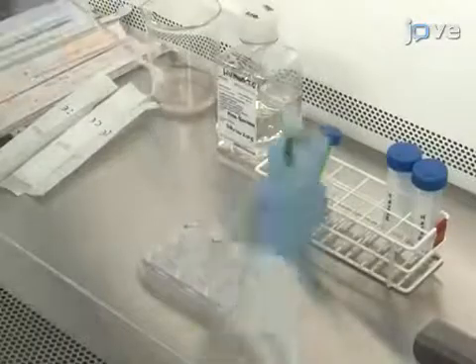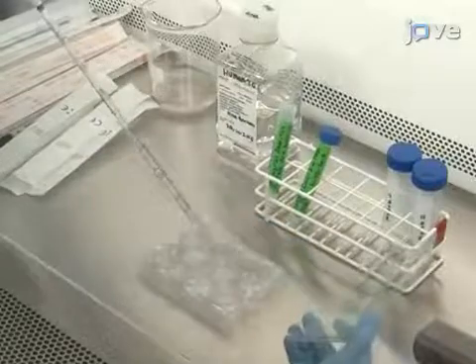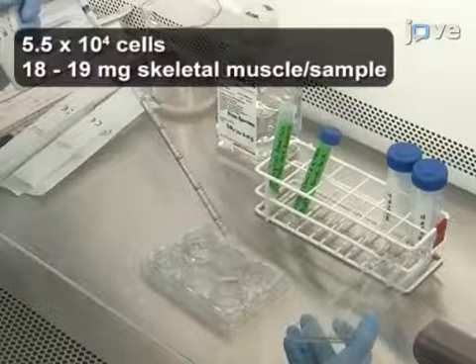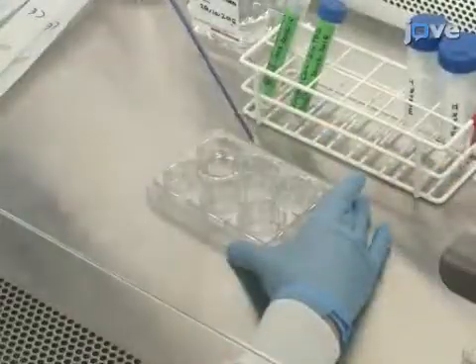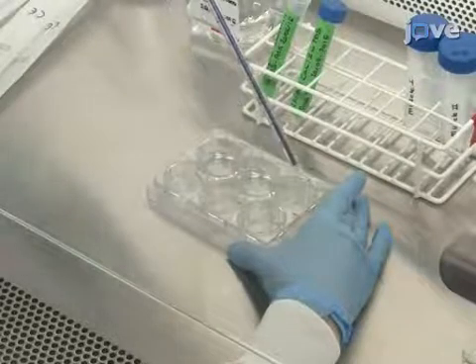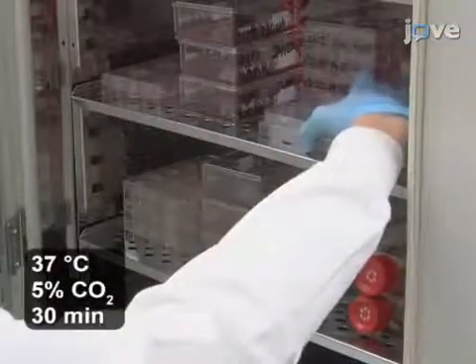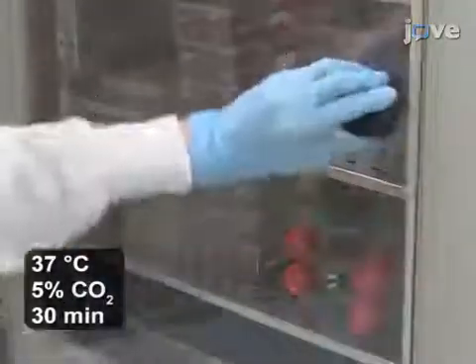Begin this procedure by preparing a 60 mm Petri dish or two wells of a six-well plate. Next, pipette a minimum amount of laminin solution to completely cover the surface of the dish. Then, incubate the culture dish for at least 30 minutes in a humidified incubator at 37 degrees Celsius before plating the cells.